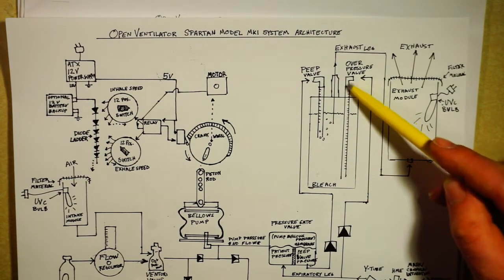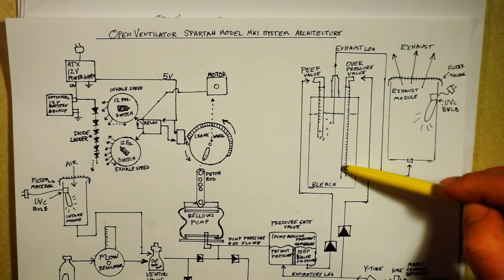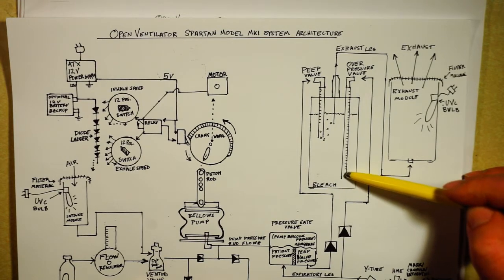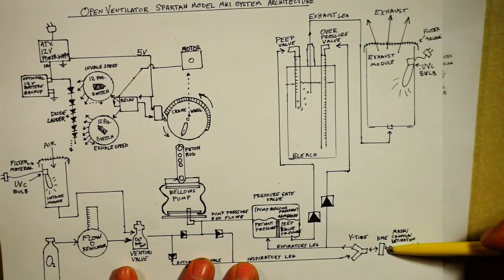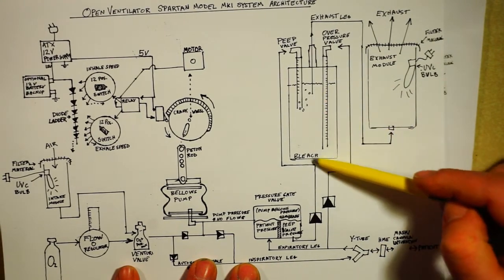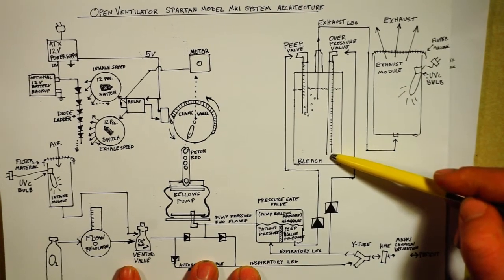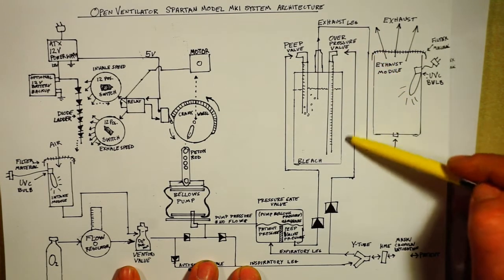And what this tube does is create an overpressure maximum setting, so that when an overpressure setting is reached, no more air is pumped into the patient, but instead it releases through this overpressure. During normal operation of the machine, if the machine is functioning properly, this should never bubble, but this is a safety blow-off valve.